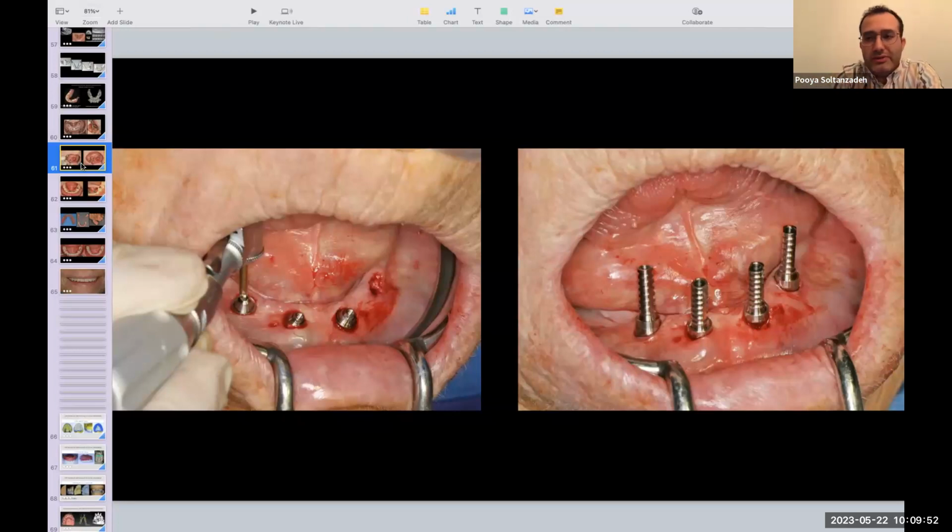It's not common to do any kind of fixture level all-on-4 type of restorations anymore. The purpose of having multi-unit is, as you mentioned, to bring everything from subgingival or at the bone level to tissue level and above. Also, these have a very good taper. They're all conical and non-engaging.